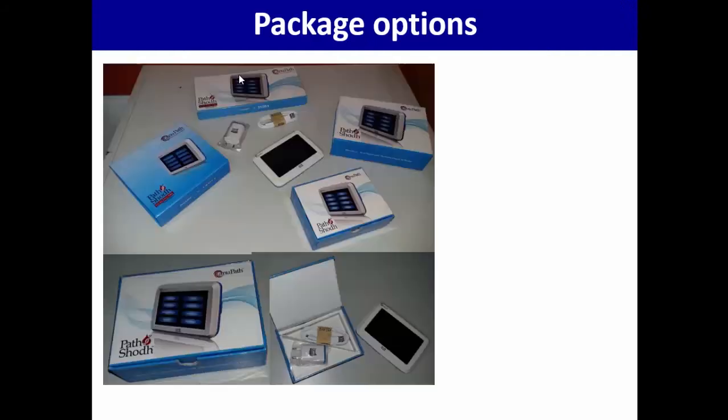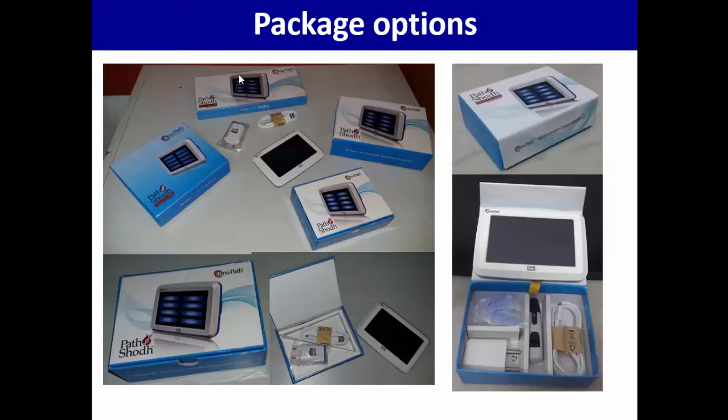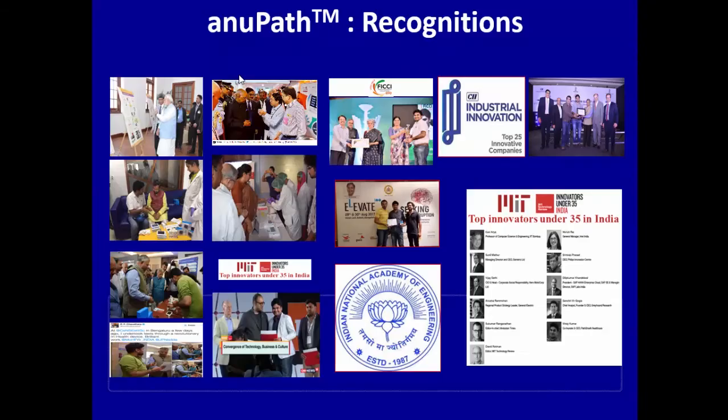Okay, you have this completely packaged device. It has to eventually be put in a carton. That is also part of your packaging. How should that be? Again, we went through multiple designs, because now we are talking of a complete product. It should actually go to the user. You need to figure out the aesthetics and get user feedback. Just being in an ivory tower and saying that I want to publish and not worry about it will not take you too far. So we went through all that, and we arrived at the right user-friendly package, which will really be acceptable for the end user.